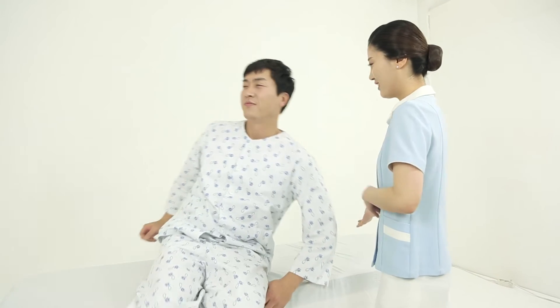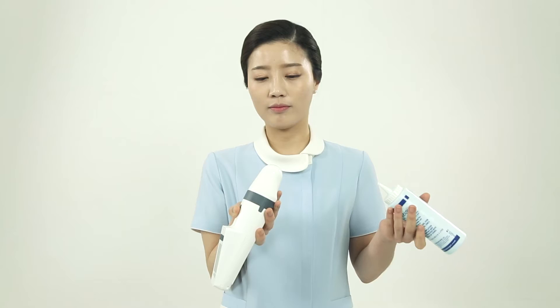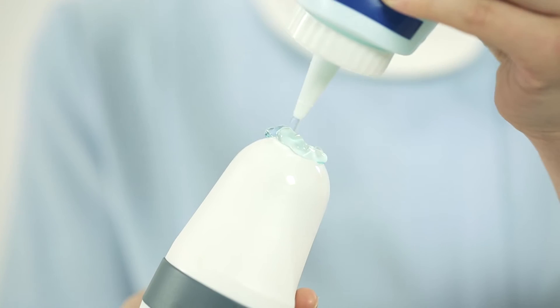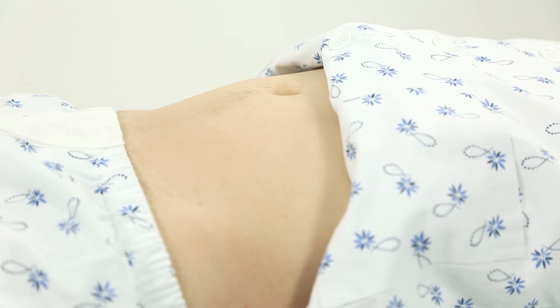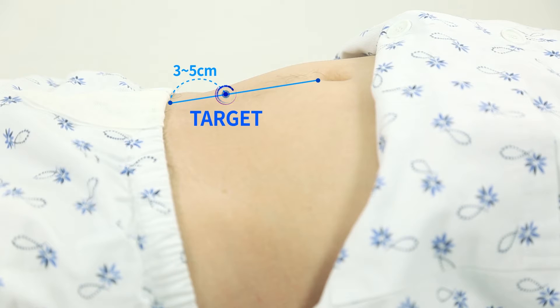Now, make sure your patient looks at the ceiling in a correct position. Rotate the wrist of the user from the position that can be seen on the screen and apply the gel on the probe. Draw an imaginary line that extends from the navel to the pubic bone and place the probe on the patient's abdomen 3 to 5 cm above the top of the pubic bone.